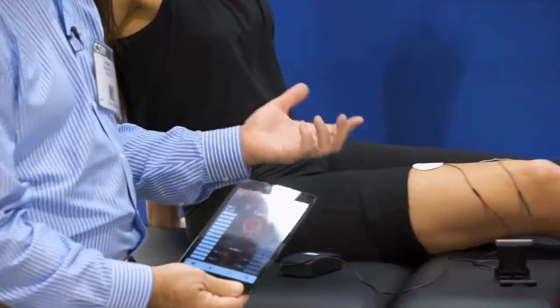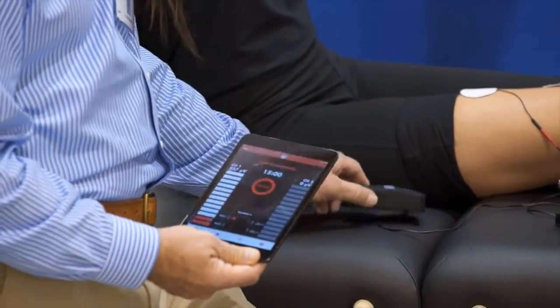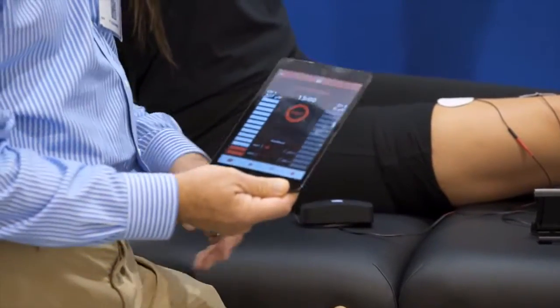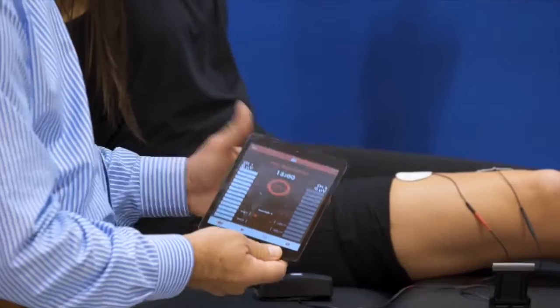This is an app you can download on your phone, and it will connect with any phone, so you can have one in your clinic that you can use on any patient that comes in. They just connect this via Bluetooth to your phone or your app, and you can adjust the threshold of sensitivity.